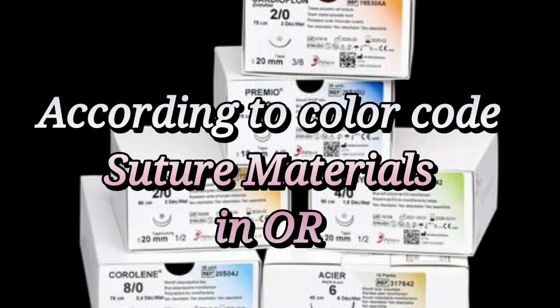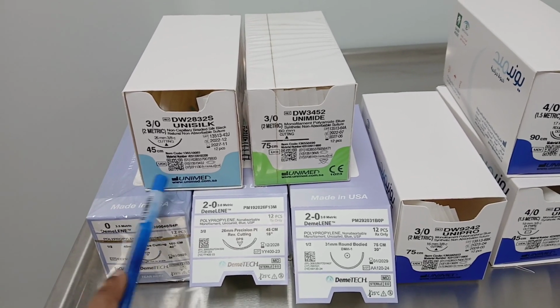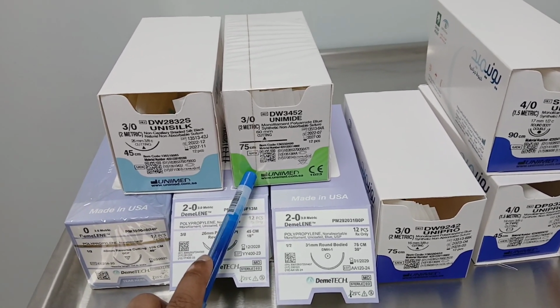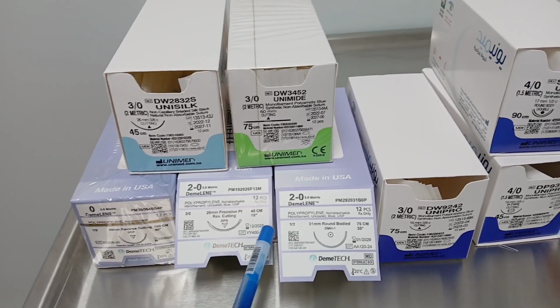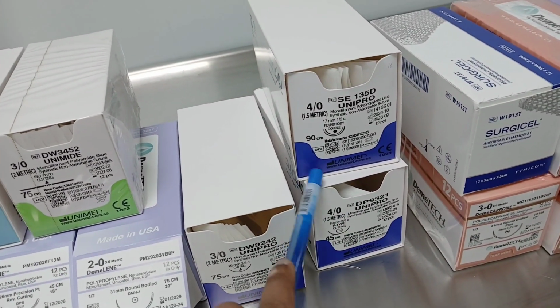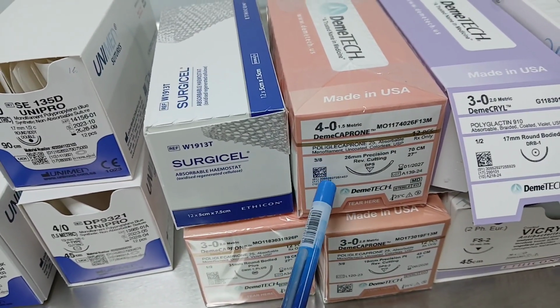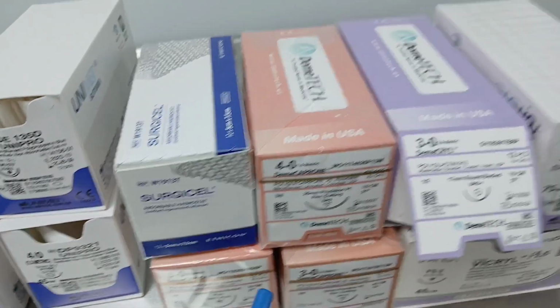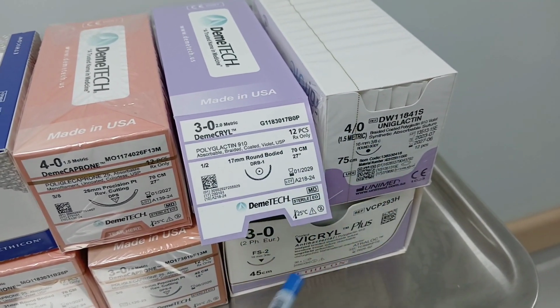Now I am going to tell another important thing. According to the color coding also we can identify the suture. For example, if the sky blue color comes, that is the silk suture. If it is green, that is the ethilon. If it is light blue, that is the prolene. Dark blue also means prolene. And light sandal color means that is the monocryl. If purple color comes, that is the vicryl suture.